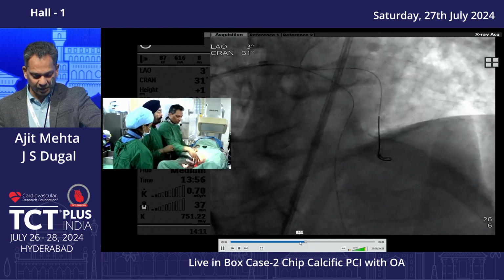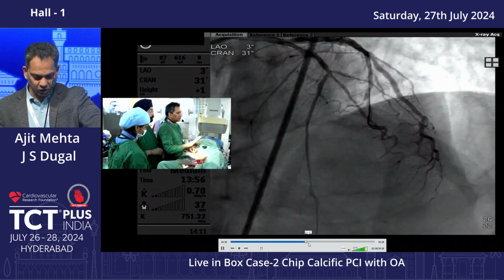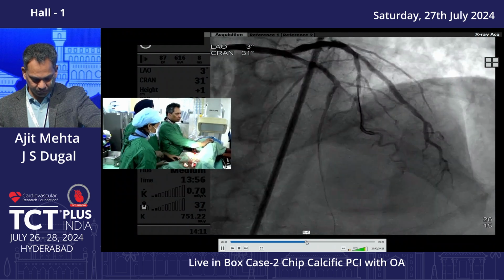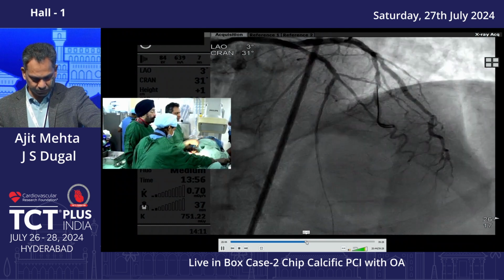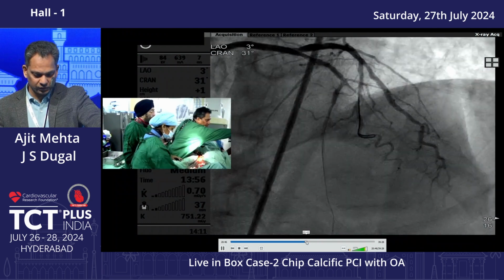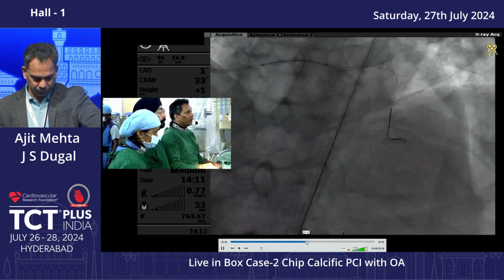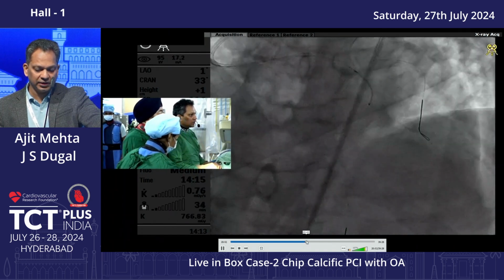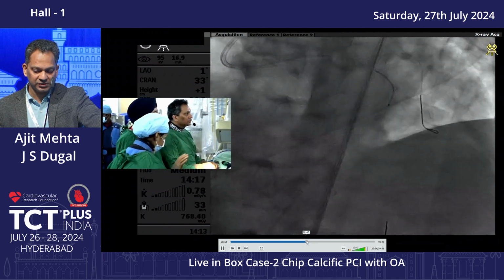The patient had angina, with slow flow in the diagonal and a little drop in blood pressure. So we wanted to keep it quick at this point of time. It was 2.5, and we needed to take a balloon, a 2.5 by 28 Xience Sierra.